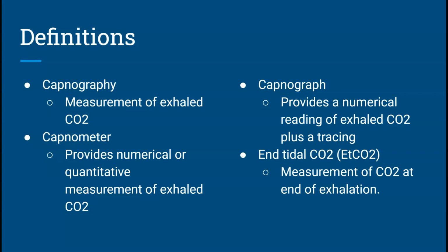This is the gold standard when you are intubating someone, is the capnography, because it gives you real-time information with a graphical explanation, right? So we talked about this a little bit last week, where you can have different shapes of the waveform, and these can tell you different things. So if you intubate someone who is in respiratory failure and you see they have a shark fin kind of shape of their capnography, this can help you tailor your treatment of this patient, right?